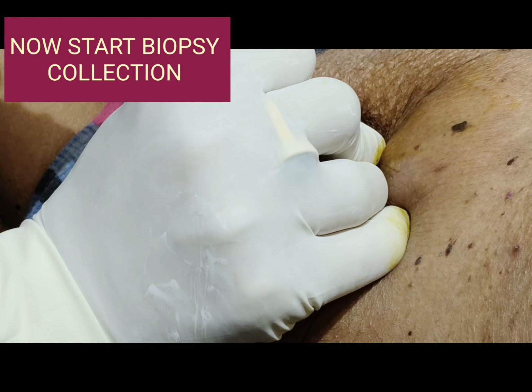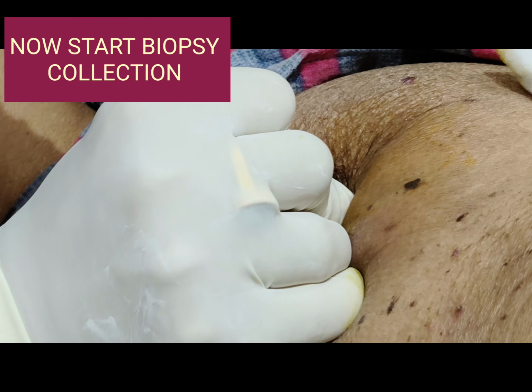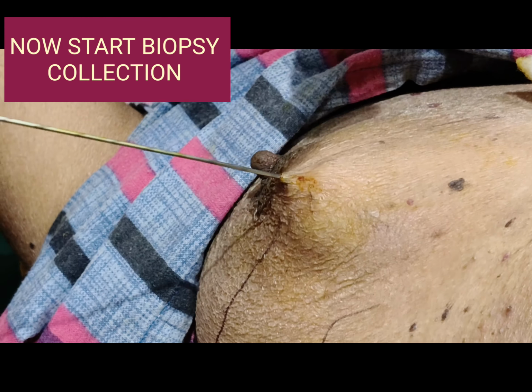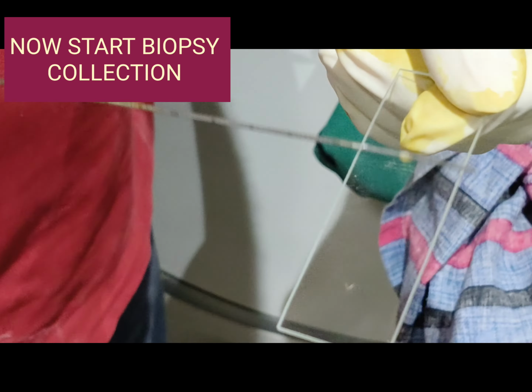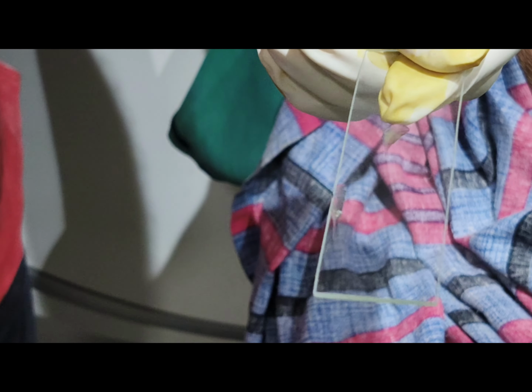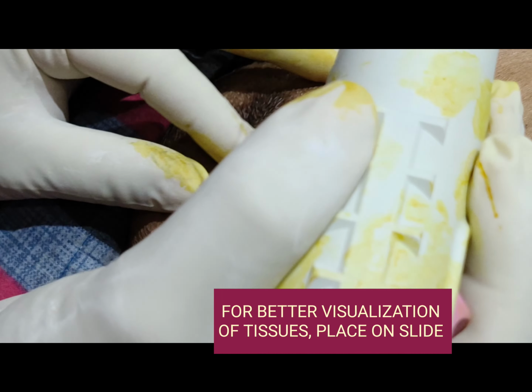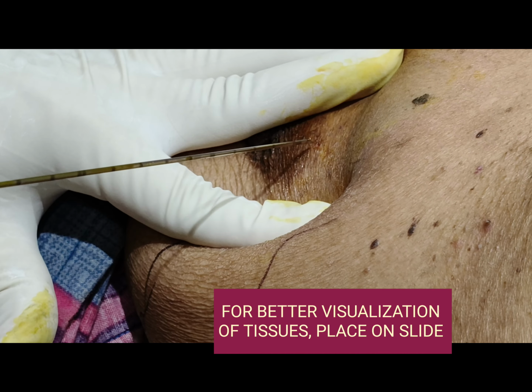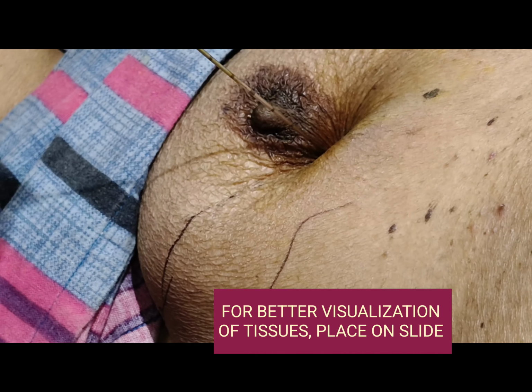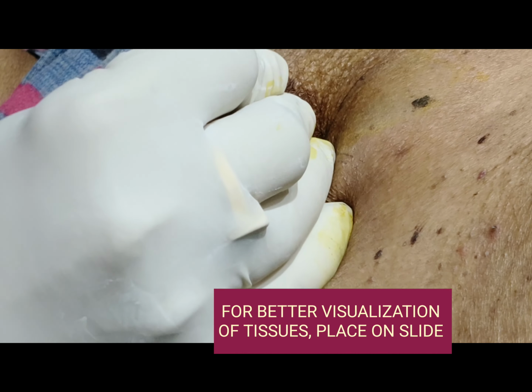As per CT scan, we can measure the distance of the lesion from the skin surface, and we can see in this gun there are markings on the gun. Each marking is 1 centimeter. So in this case, it was 5 centimeter away, deep from the skin surface.